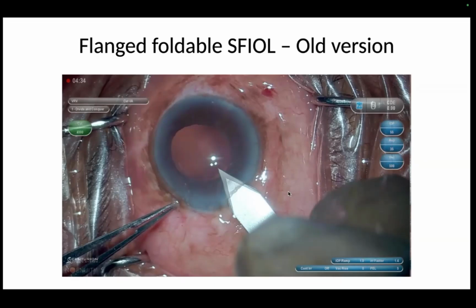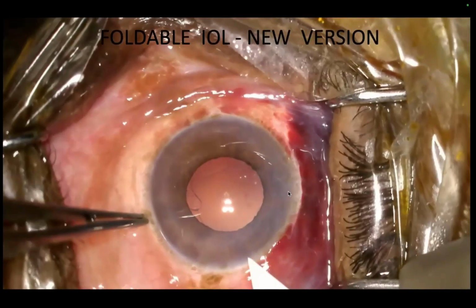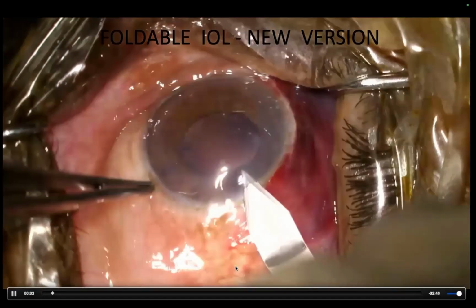So now, instead of passing it through the cartridge, it's very time consuming, and there is a high chance the suture can intertwine. It's very, very difficult to do as well. So now what we've started doing is going back to the old holder folder technique. I'll just go through this video.